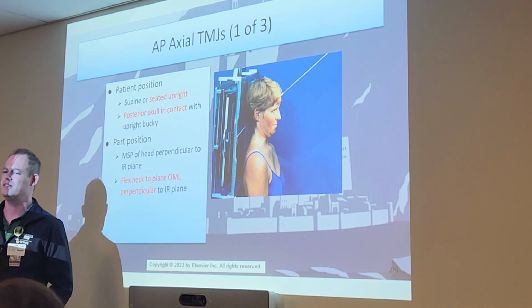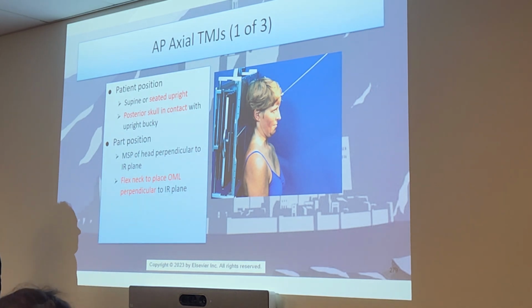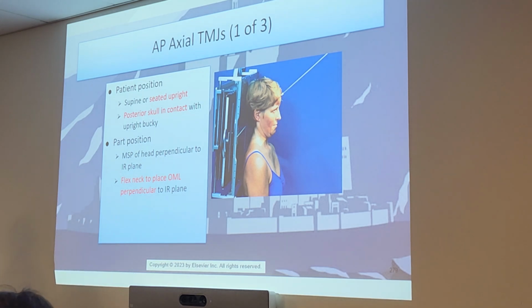It's going to be, I think, above glabella. I have to always review these because I've only done these once in my entire career. Is it similar to the Townes, or is it like the hairline?